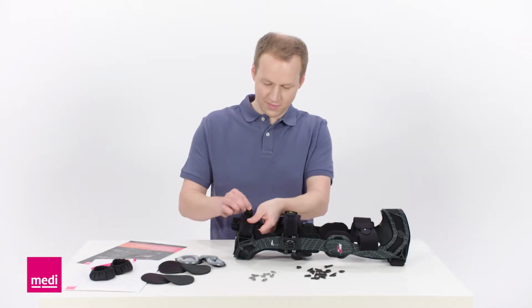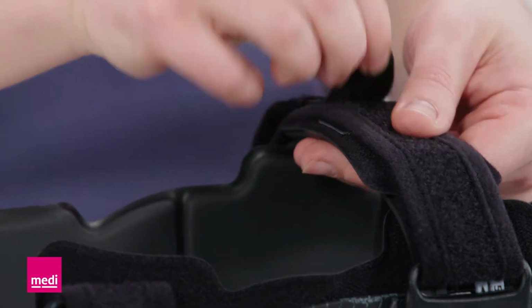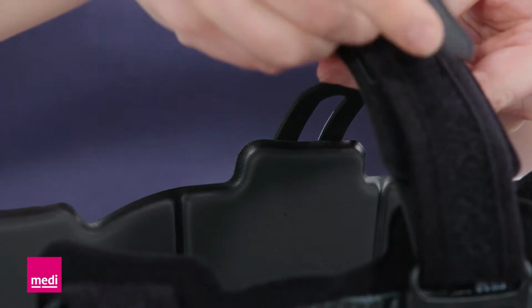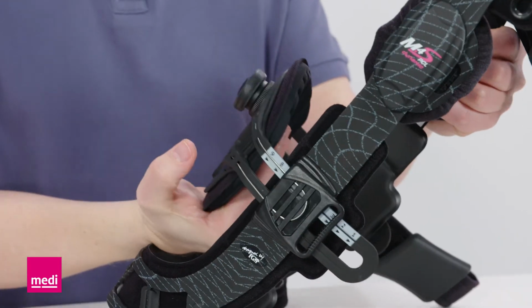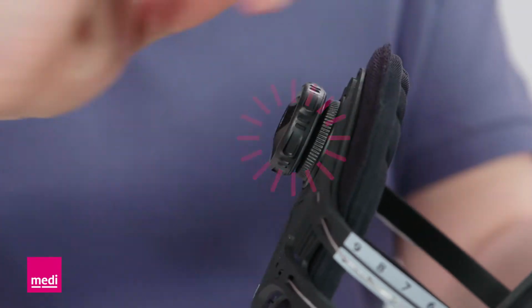Ensure that all belts are unfastened. It is best if you pull all belts out of the plastic eyes and close up the Velcro straps to prevent damage to clothing during application. Pull the tensioning dial out until you hear a click. Now pull the support pad out until it stops and re-lock the tensioning dial.